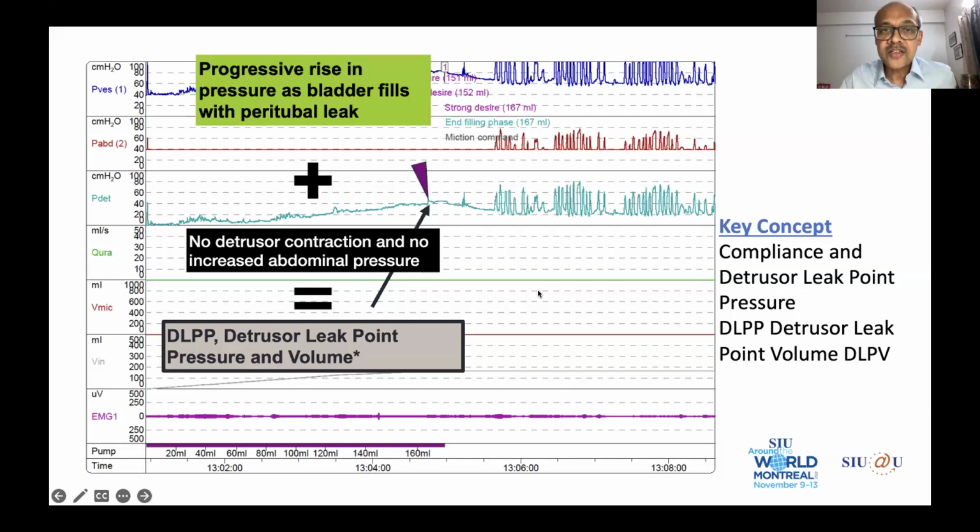And in neurogenic patients especially, a video study is crucial, because on the video study you'll pick up all these things. Is there a diverticulum causing a pressure pop-off? Is there a reflux causing trouble, so that you're not interpreting the pressures correctly, and so on?